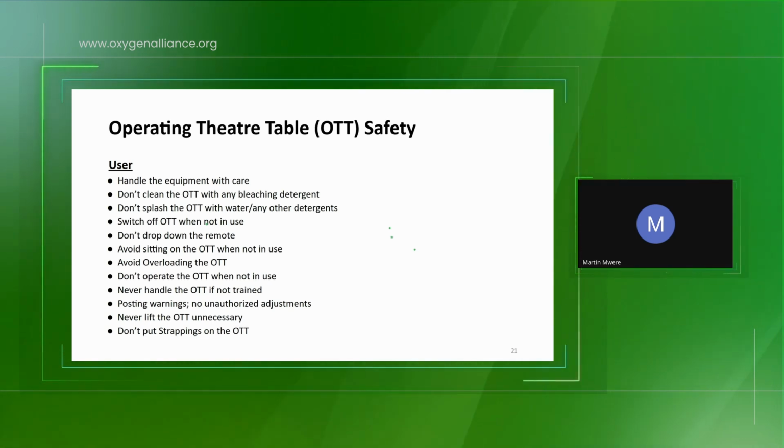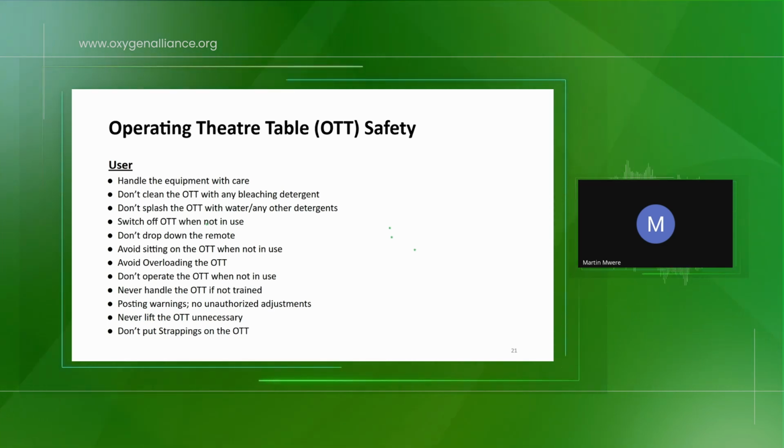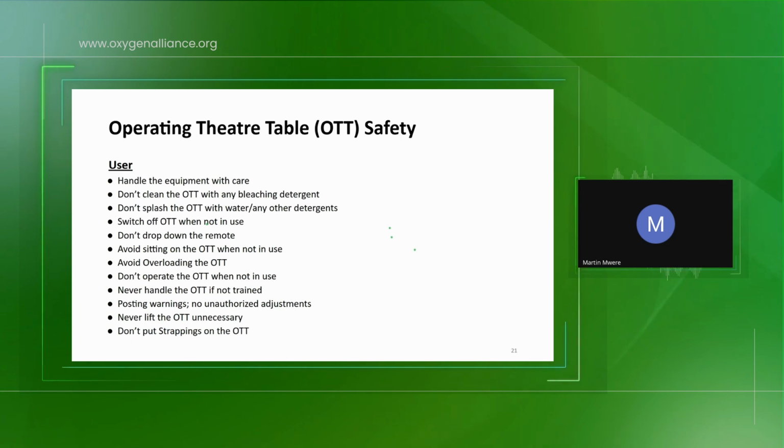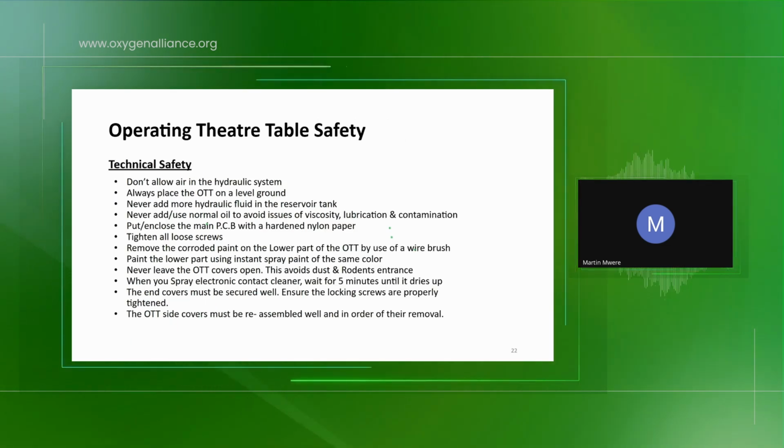Never lift the operating theater table unnecessarily. Don't put strappings on the operating theater table. Remember, these are all safety from the user side. We come to the technical safety.